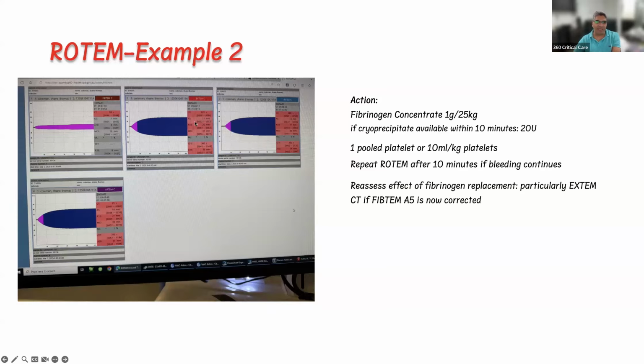So you need around a 20 increase from that to there. A5 should increase from 7 to 27 to say that the platelets are adequate and it's only fibrinogen. Because the increase is around 10, it's not too high. But again, this is just a rough estimate. It's very hard to see how much platelets are contributing to this abnormality, as long as you correct the fibrinogen first. But again, we sometimes look at the difference. If the difference is not too high, that means there is a contribution from platelets also. Okay.